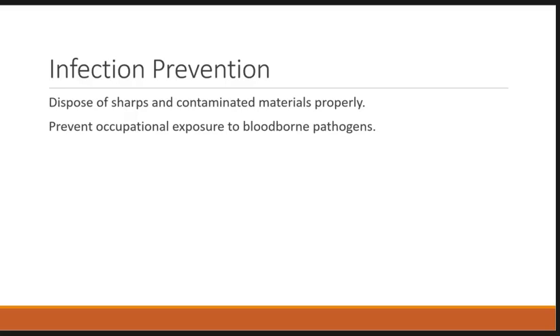You will follow infection prevention procedures, including safe disposal of sharps and contaminated materials. So as soon as the specimen is collected and you've documented your results, all used lancets, test strips, gloves, and contaminated materials should be disposed of according to institutional infection prevention and biohazard waste policies. Proper sharps disposal reduces the risk of needle stick injuries and occupational exposure to blood-borne pathogens.